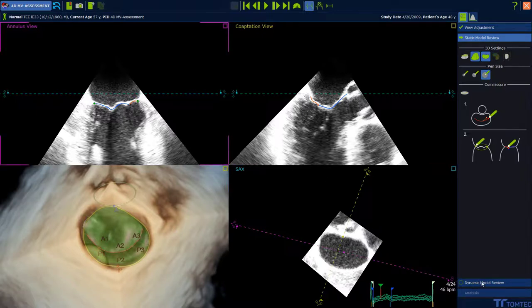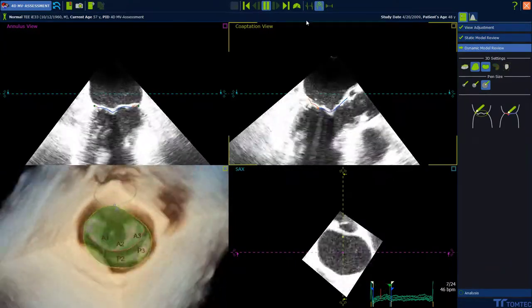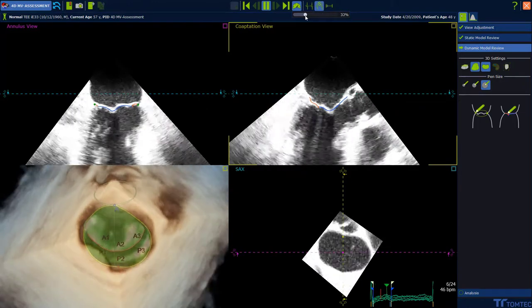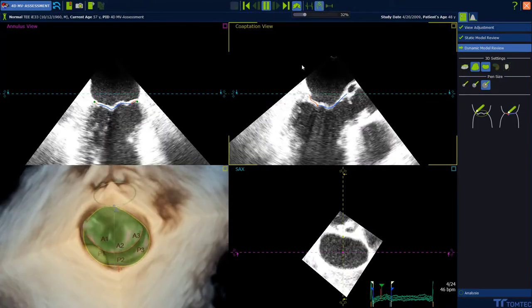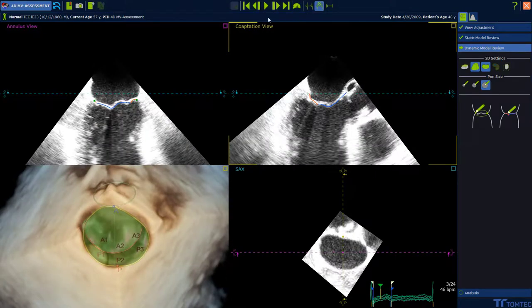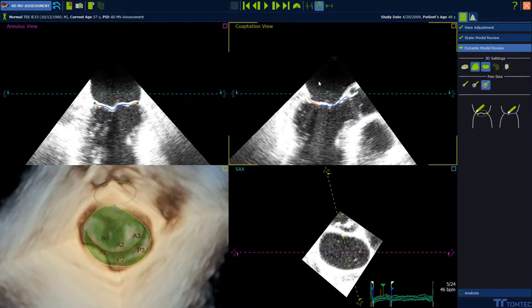Select dynamic model review to visualize a systolic dynamic model. To evaluate the tracking, reduce the velocity. Adjust the proposed contour of the leaflets in each frame by drag and drop if necessary. Use the next frame or previous frame button at the toolbar to continue to the next frame and make further adjustments.